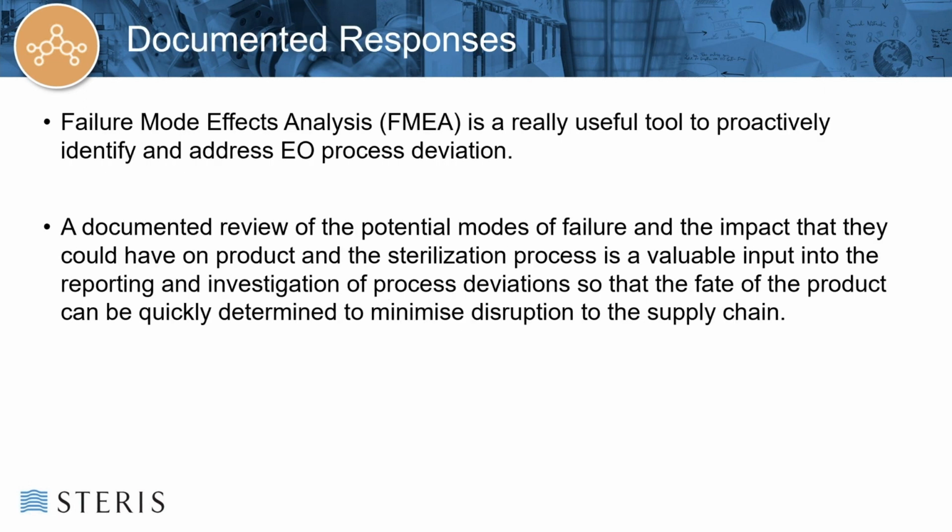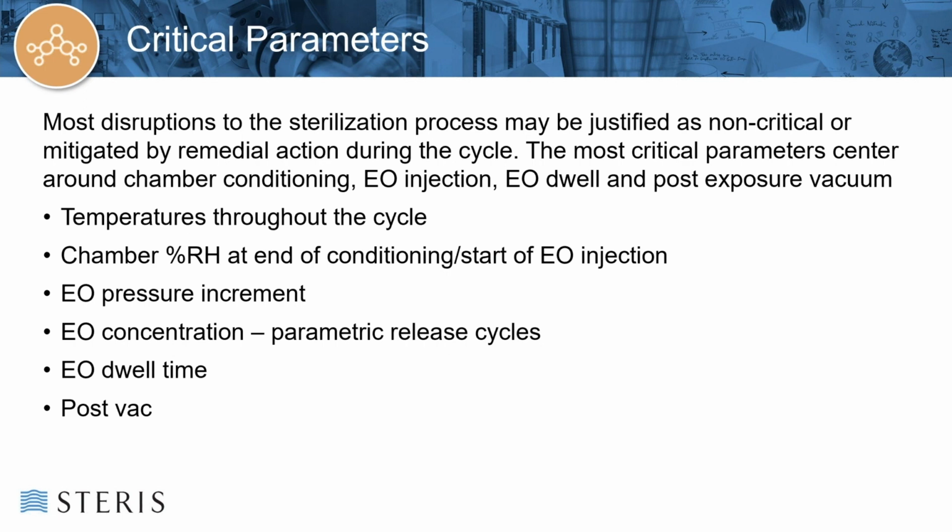Develop a plan, make sure that you have process resilience, identify what documentation has been generated, and your failure mode analysis documentation can point to those validations. So it's all in one place. You don't have to go searching through your documentation system looking for keywords. You record it directly in your failure mode analysis document. Here was our concern, here's how it was met, here's the document that generated the data to support the decision that was made or can be made.